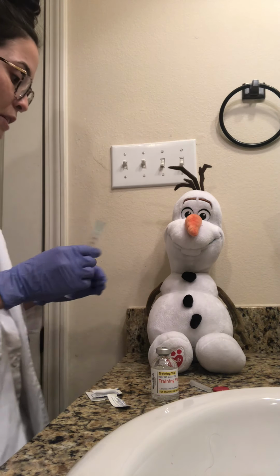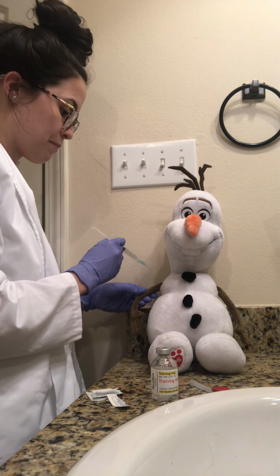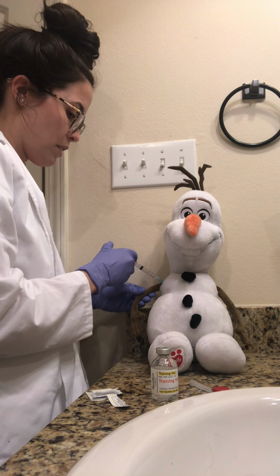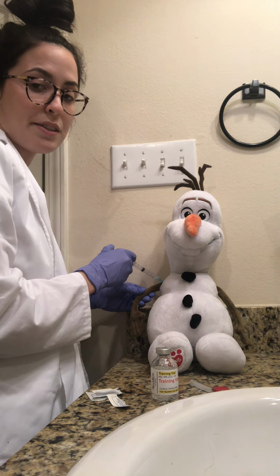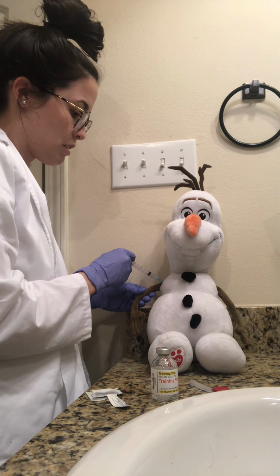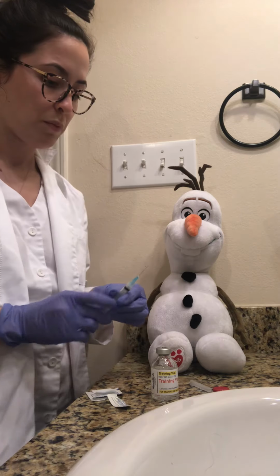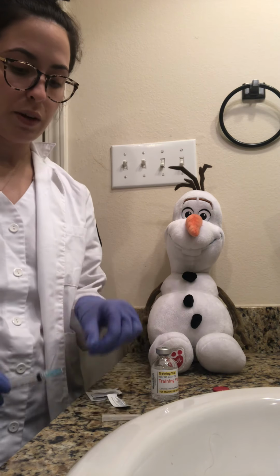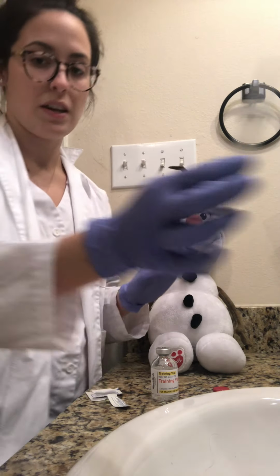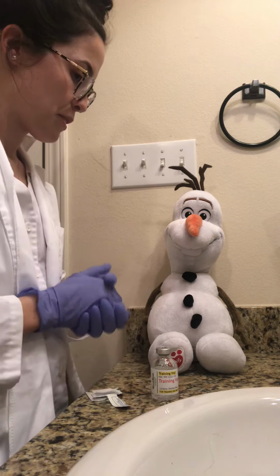All right, Mr. Olaf, I'm fixing to give you your medicine right here in your shoulder. It's going to be a big stick, okay? All right, 1, 2, 3. And you want to administer the medicine slowly. Doing great, Mr. Olaf. All right. And you want to safely recap the needle, just like so, and dispose of it in the sharps container. All right, Mr. Olaf, thank you.